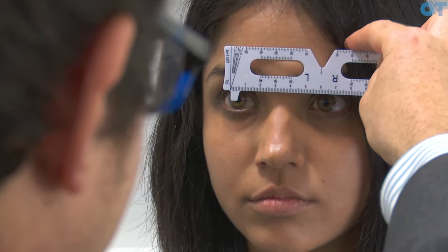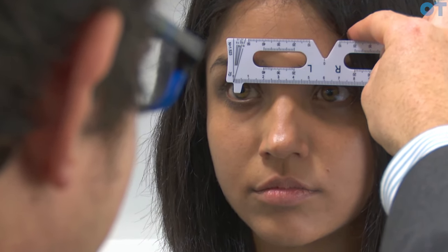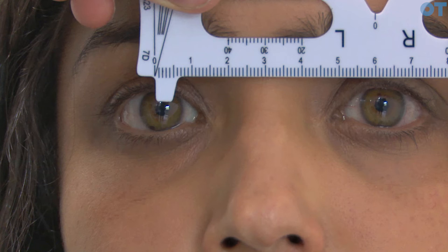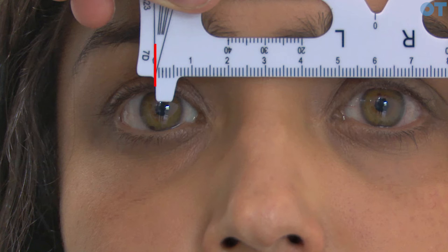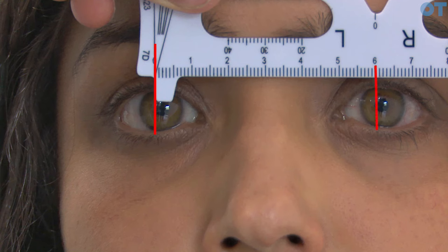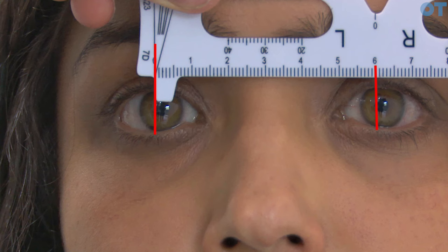Now we're going to measure near pupillary distance. We assume a reading distance of 40 centimeters from the patient, so I'm going to sit 40 centimeters away from the patient's eyes. I'm going to use just my right eye for this measurement, getting the patient to look straight into my right eye while I place the PD rule with the zero mark on the temporal pupil. Next I look at the left eye and note at what distance the nasal side of the pupil is on the ruler.